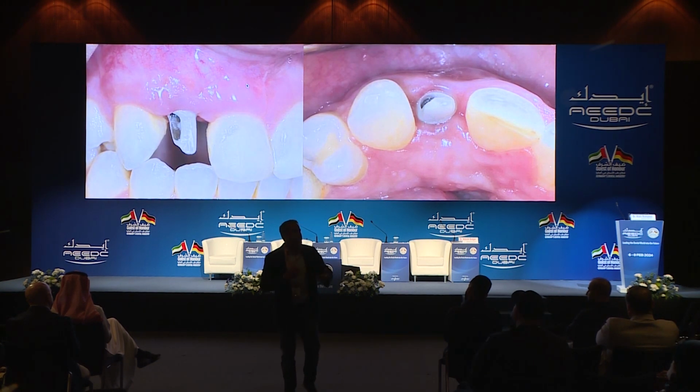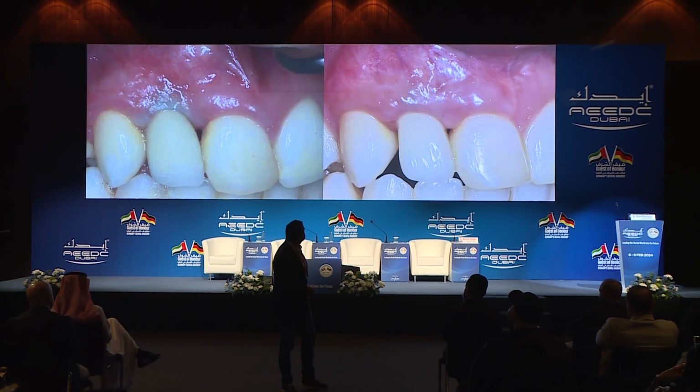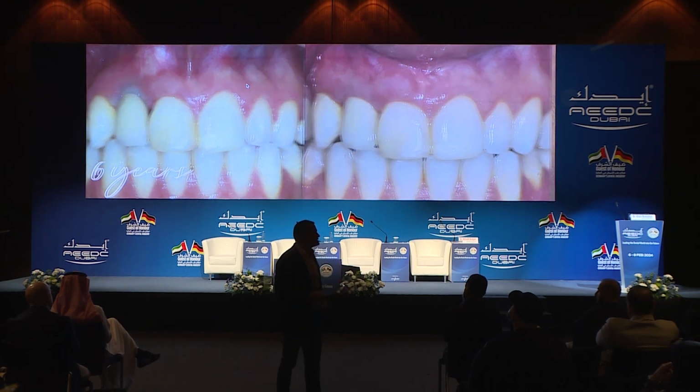We did the gymnastics to find the right abutment, because this is an old case, 2013, and we did not have the right angulation. So we had to struggle to get her to the right angulation. And this is how we started, and this is where we finished. We were able to have an acceptable result, probably not the best outcome, but it's an acceptable result from where we started.